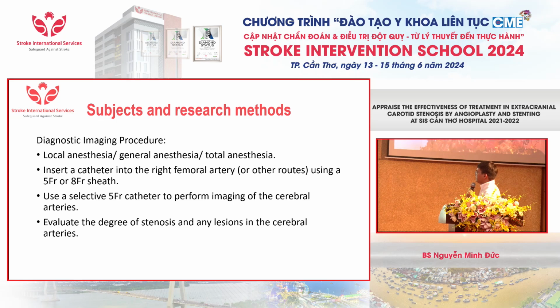For the diagnostic imaging procedure, we can use local, general, or total anesthesia, but for almost all cases we use local anesthesia, 100%.